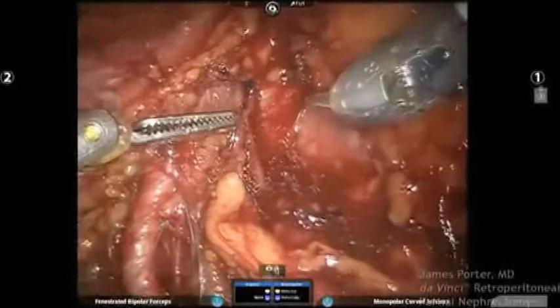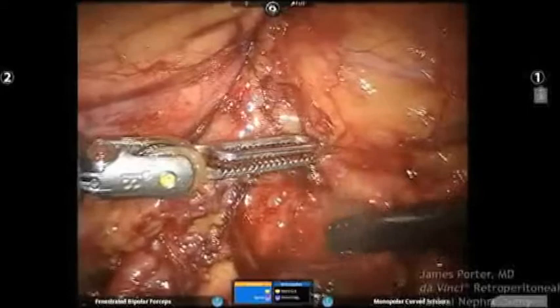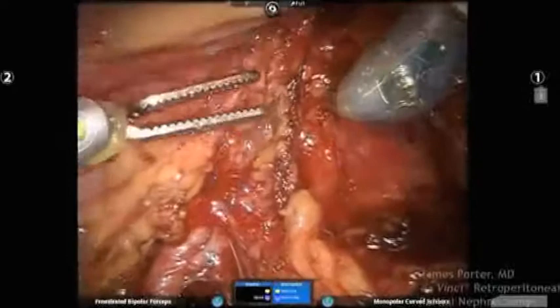Okay. But generally speaking, artery only. I think Ari Shaw has had some data indicating that the ischemic damage to the kidney is less if you clamp only the artery and not artery and vein. So it's an adjustment you have to make based on the location of the lesion as well as what you see when you begin to resect your lesion.